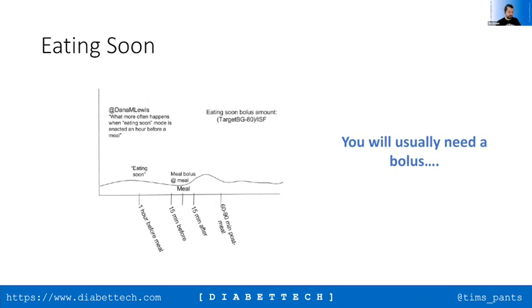Okay, fine. Sorry, when I said a huge amount of insulin, maybe not the actual words used, but it was a gesture that was always: don't have insulin aboard until you've eaten. I'm looking at Loop, and at the bottom there's an icon that's grayed out, which is probably the insulin on board, but it is the eating soon that's grayed out, so I need to obviously read the docs. I'm not sure why that would be. Yes, grayed out.